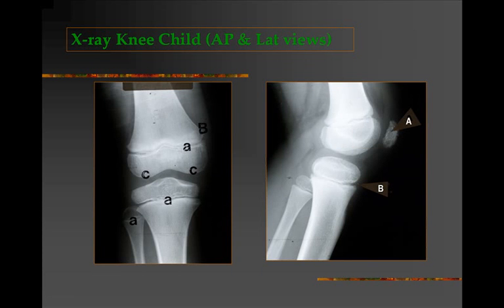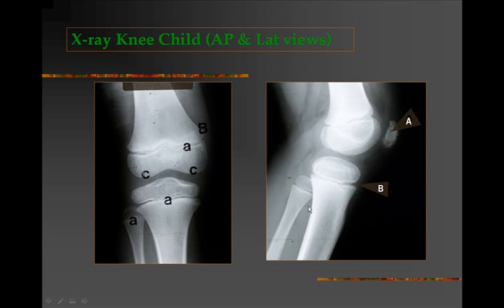Let us now look at an x-ray of the knee in a child, with an AP view on the left and a lateral view on the right. One notes the medial and lateral condyles of the femur with the epiphyseal line or growth plate which is not fused. The tibial plateau with medial and lateral tibial condyles is visible, again with a visible growth plate. There is also the head, neck, and shaft of the fibula and shaft of the tibia. In the lateral view, the patella or kneecap, femoral condyles, tibial condyles, and fibula are clearly seen.